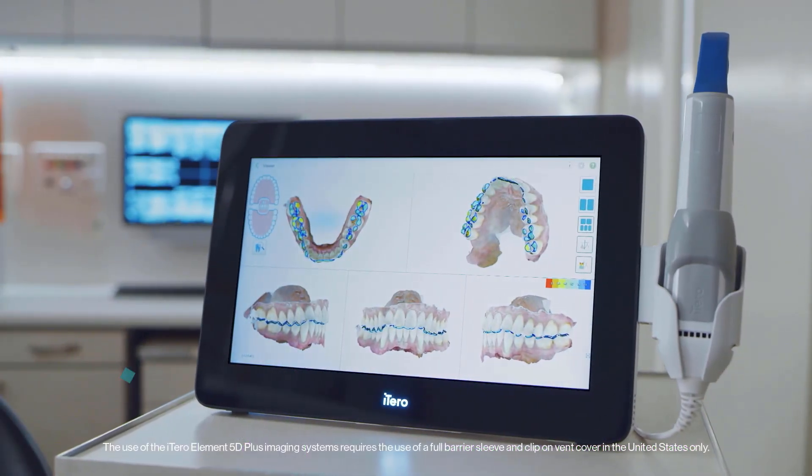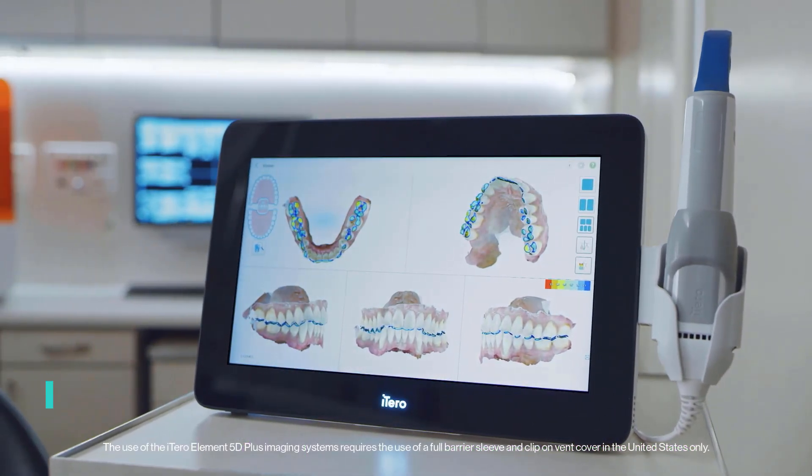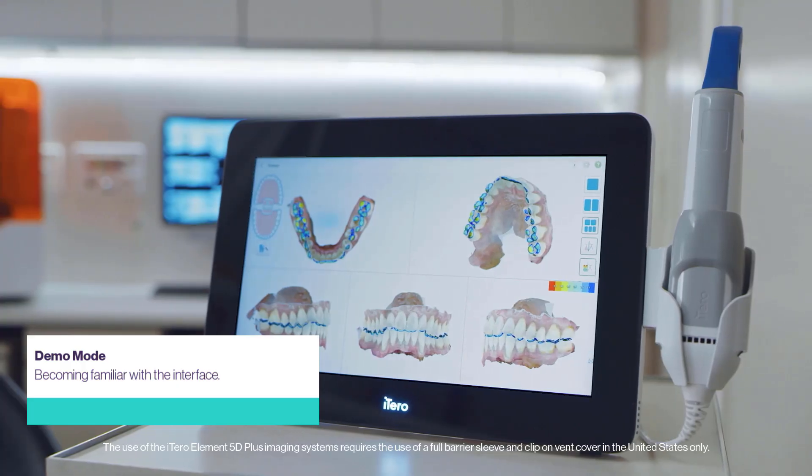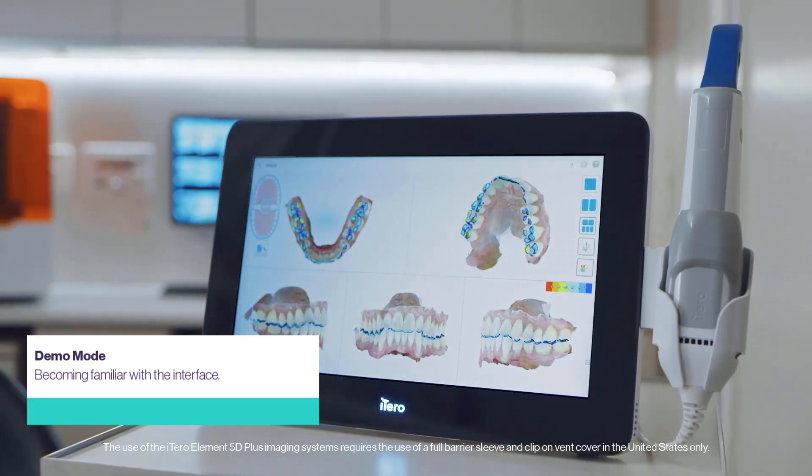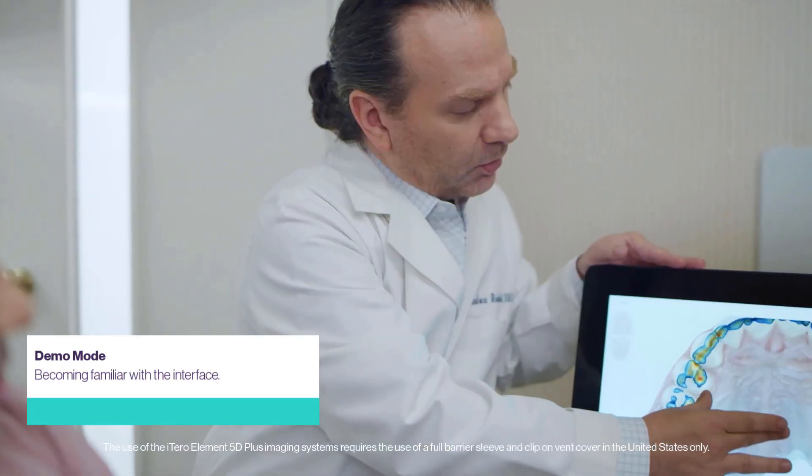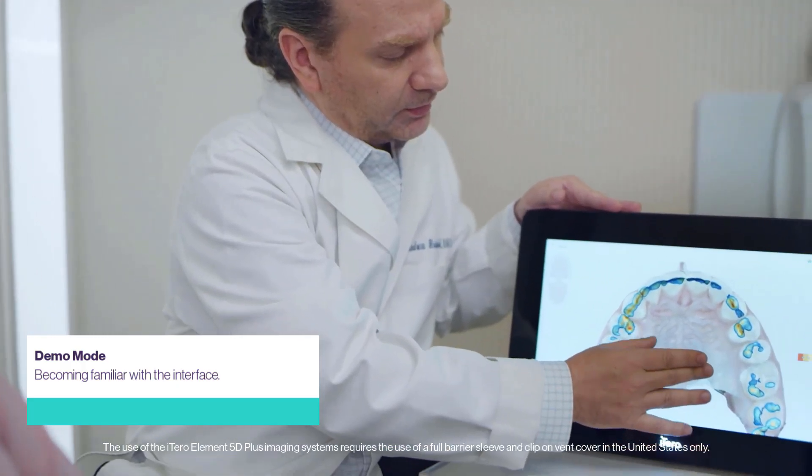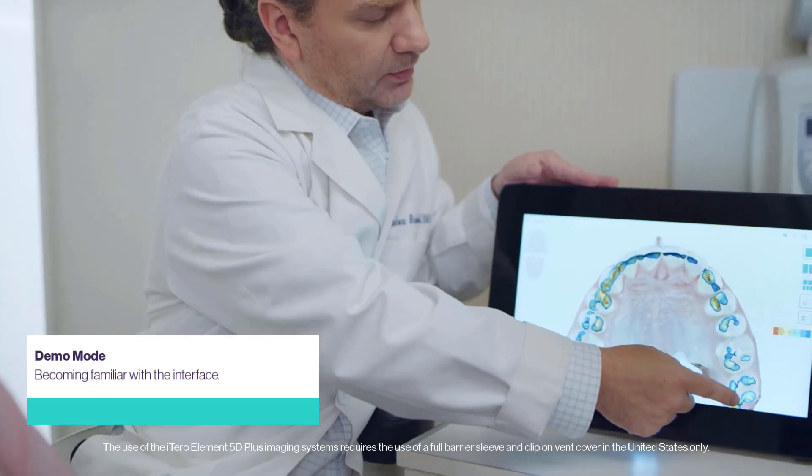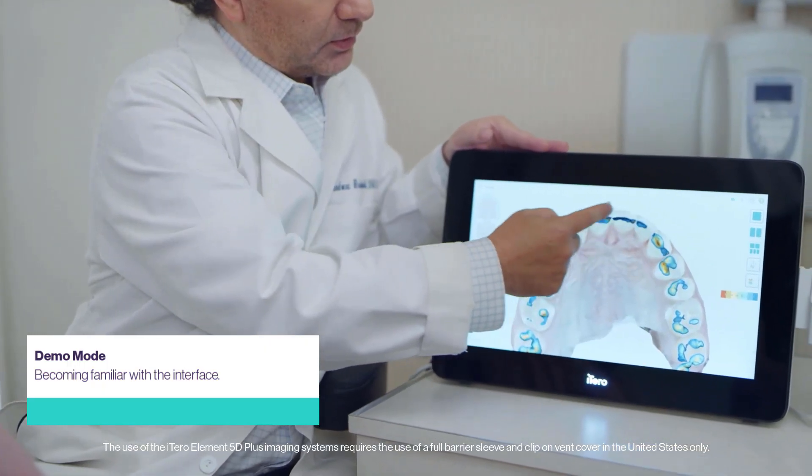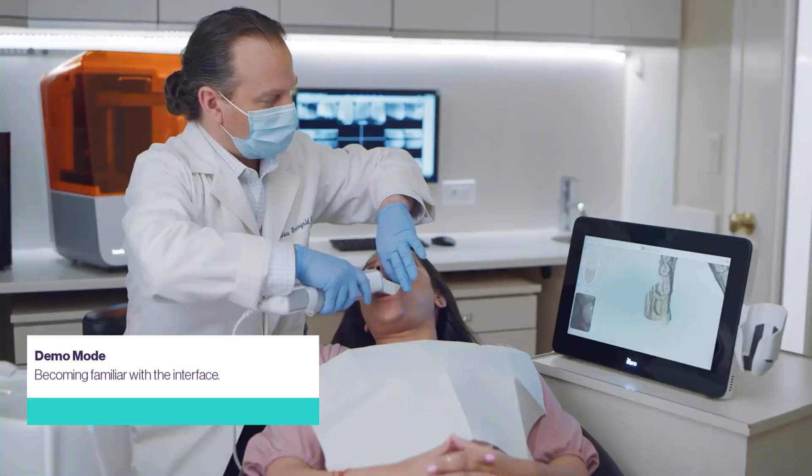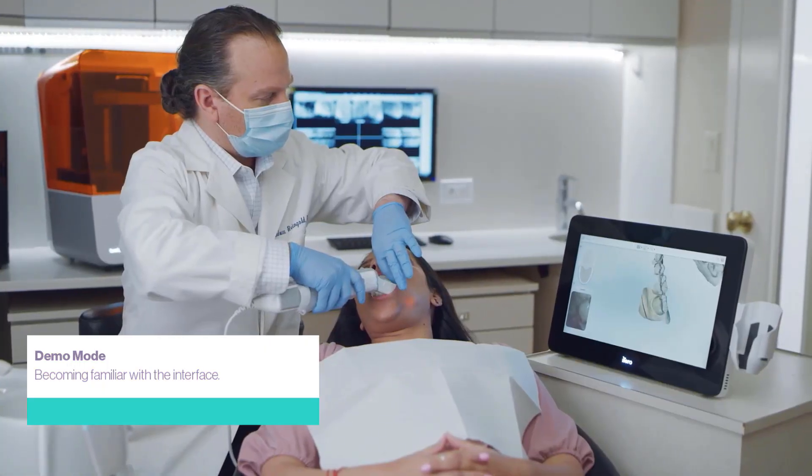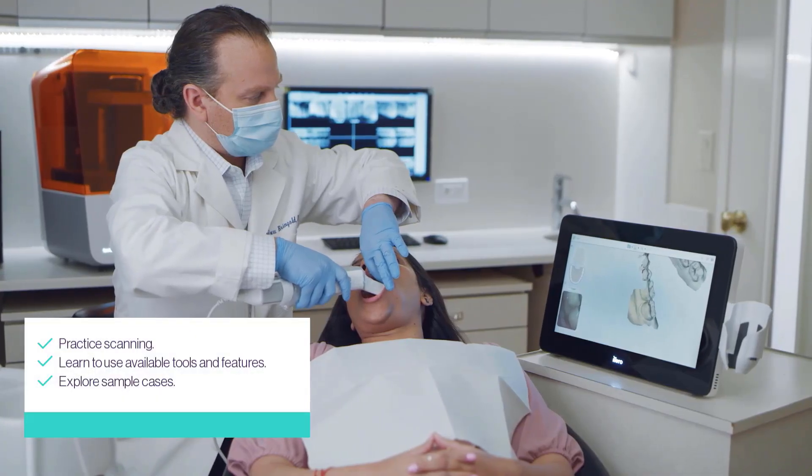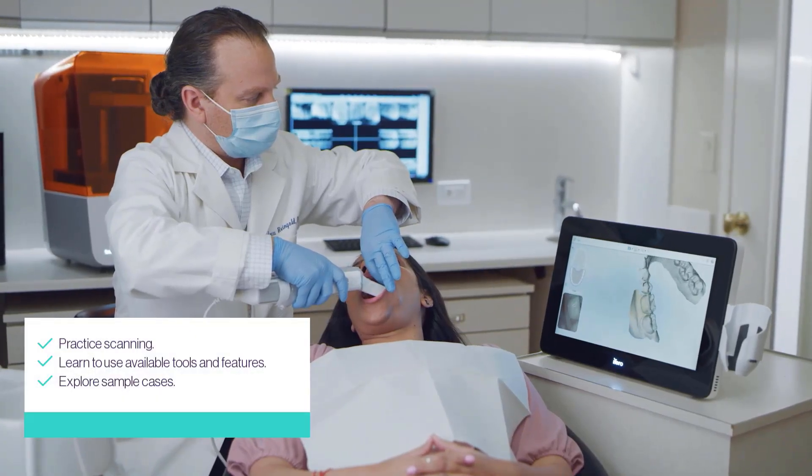Demo mode enables all dental professionals to become familiar with the iTero scanner software interface and practice using it during all stages of orthodontics and restorative cases, from creating a patient Rx to viewing scans.